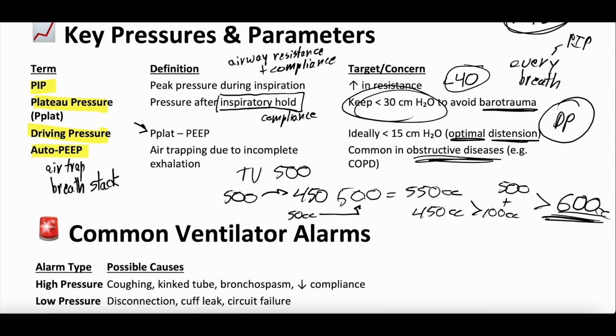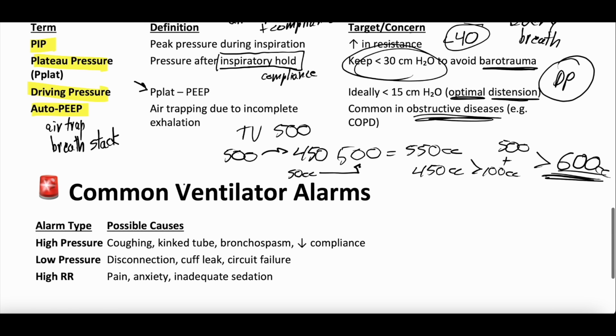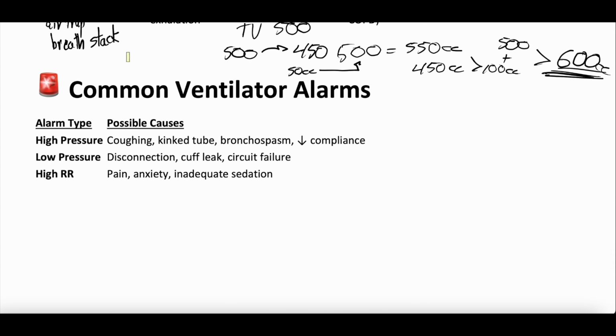And over time, that creates higher pressures in the lungs because those lungs are just getting full of air. They're not exhaling it. It can be really, really dangerous. It could even be deadly. So auto-PEEP or breath stacking, something to think about. Again, we won't dive deeper in this episode, but definitely check out those other episodes or let us know if you have questions.